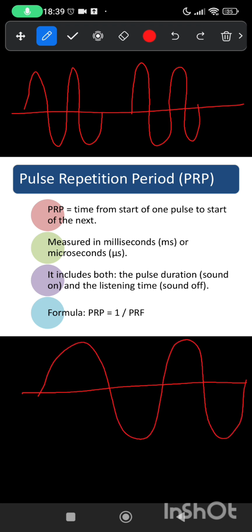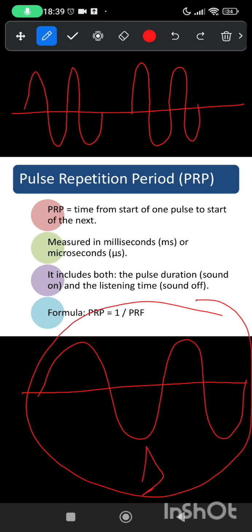Now there is one total pulse in 1 second, and here there are 2 pulses in 1 second. So we can see this pulse has more time now. All 1 second time goes to this one pulse, and here 2 pulses. So 1 second time has been divided between these two. Both get only 0.5 second time. So when there are more number of pulses, the total time one pulse takes is reduced.